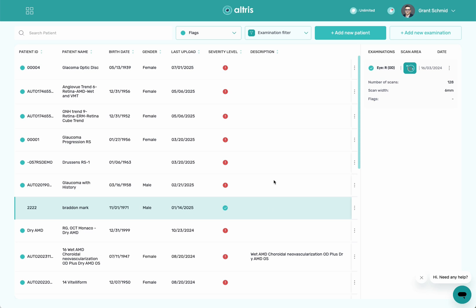You're going to see all your patients listed here, and you can filter by patient ID, patient name, birth date, gender, the last time it's uploaded, severity level, or the description.